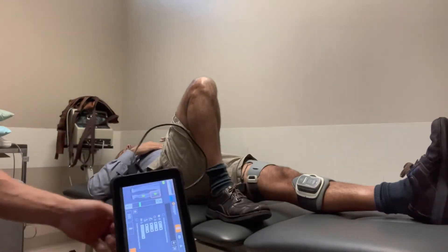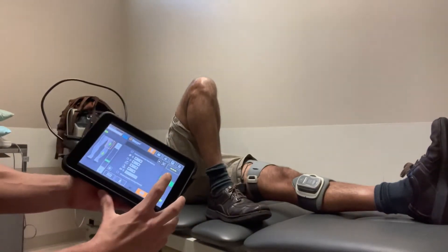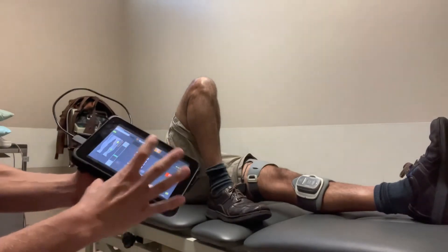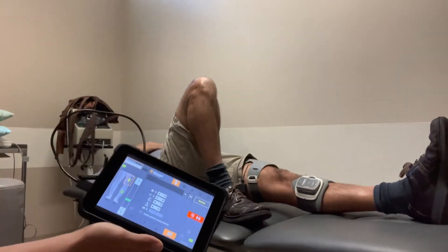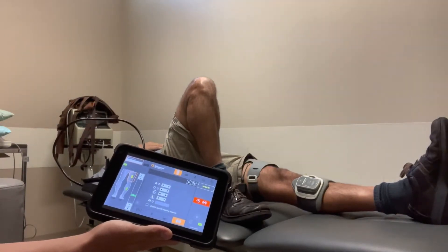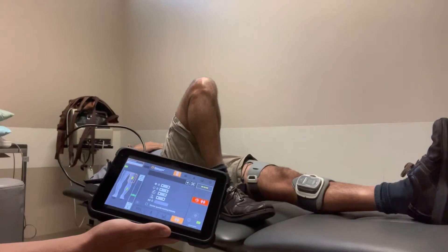The first exercise we can do is isometric quad sets. We have this on an eight-second timer. Brian is actively contracting the quad as the stimulation turns on. We'll go through one more cycle of this.